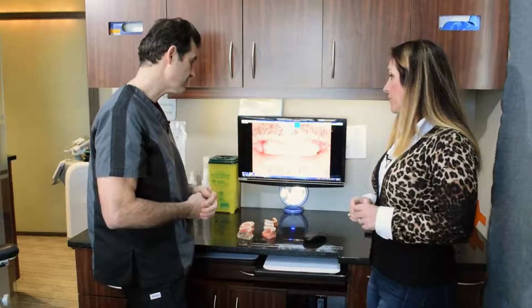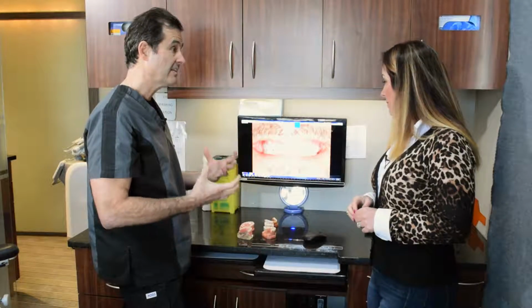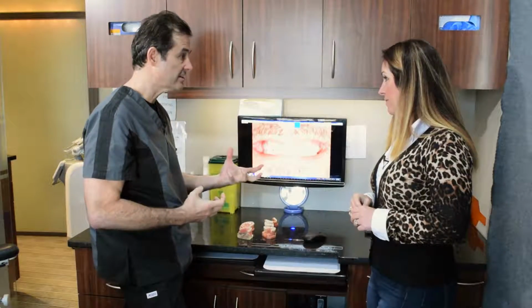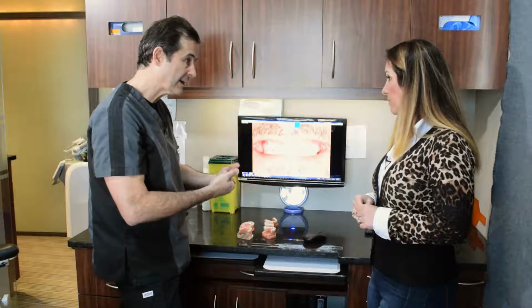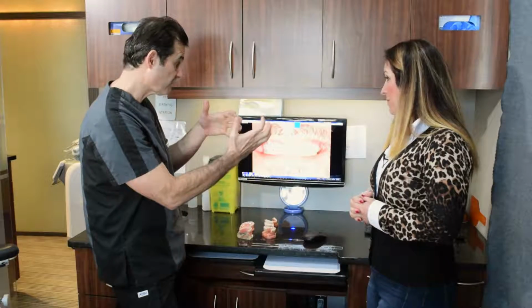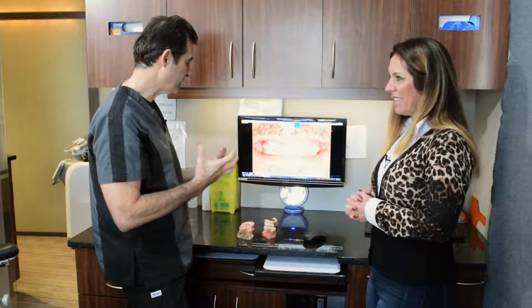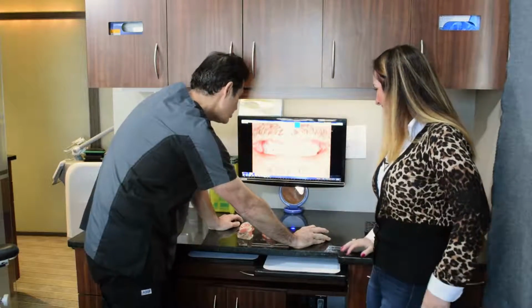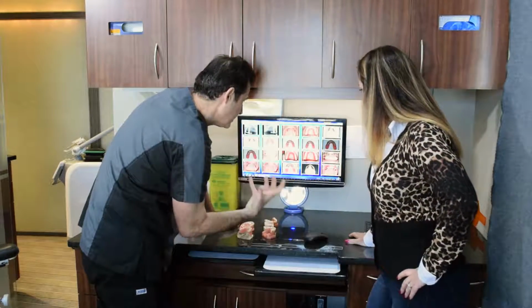The other problem that we see sometimes with these prostheses is that people can chew now so hard that they can sometimes break these plastic teeth. Wow. Because these plastic teeth were designed to be used without implants. They were designed for biting at 50 pounds per square inch. Now you start biting at 350 pounds per square inch, and if you have a chew that's a little off, say you slide your jaw forward and bang into your front teeth, I've seen people actually fracture teeth off of these things because the denture tooth just gets crushed. That's aggressive. Yeah, that's how hard they can chew with these. But certainly from a functional perspective, this is a very, very nice prosthesis.